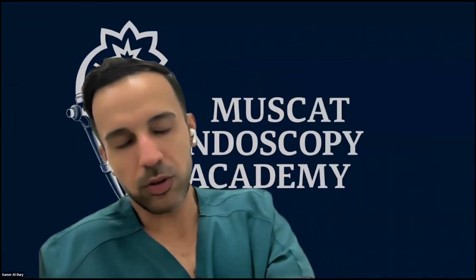I kind of memorize it, or what do you call it? Yeah, you know what I mean, I pre-plan. The strategy is clear from the beginning, and I think it's very important to vocalize this strategy to your assistant, of what you're planning to do exactly: we're going to be removing this, and this is how we're going to go about doing it. Do you sometimes feel that you need to re-inject to get lift again when you're doing cold snare?